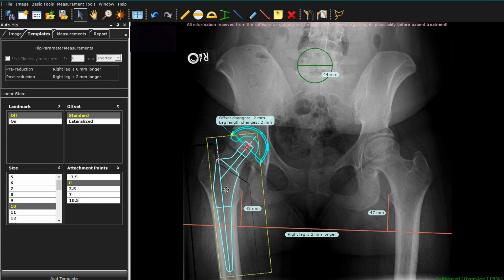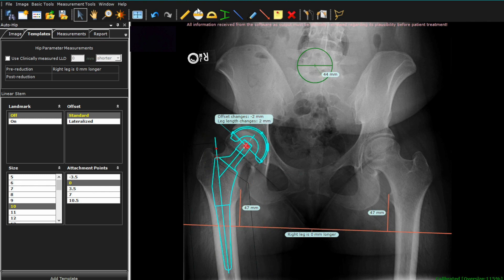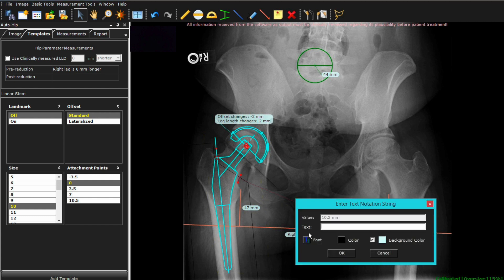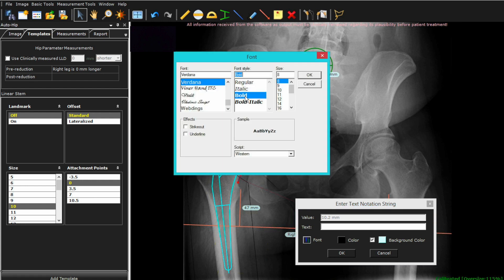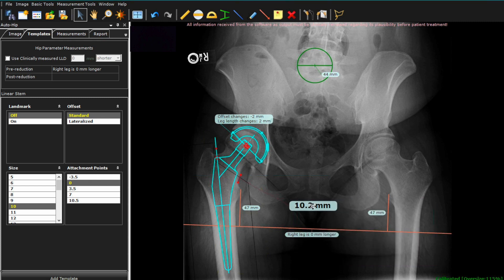We're now going to detach from cup again to put things back where they were before, and we're going to go ahead and get the ruler tool and measure from the top of the lesser trochanter to the cut edge of the stem. We're going to utilize that intraoperatively to have a number to gauge where to make our neck cut. I'll then click on this number and click on the font — I like to make this bigger, bold at 16 font — so our neck cut is going to be 10.2 millimeters in this case.